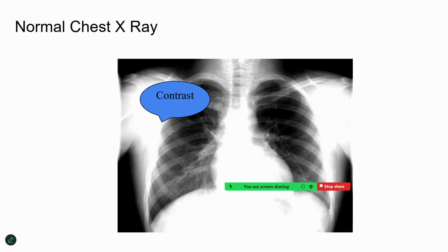The indications for chest X-ray could vary from a simple condition like an inflammatory pathology of the lung, to malignancies related to the respiratory system, or it also could be related to the bony structures, like injuries to the bones or displacement of the bones, which could be studied by the X-ray, or it also could be related to extrapulmonary pathologies. Many times, some of the lesions of the abdomen also could be read if they are found in the chest X-ray as such. But all that we would be focusing on today is the respiratory area.